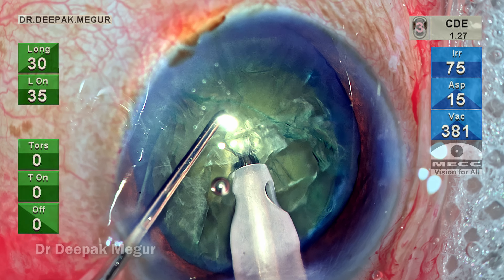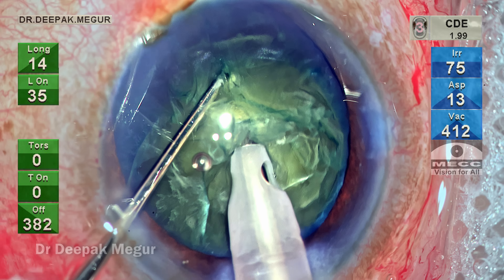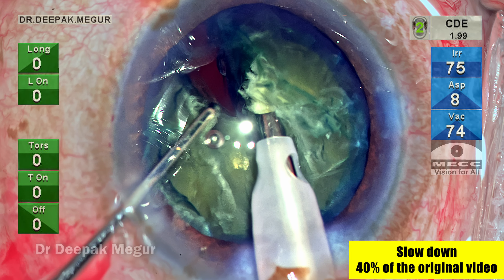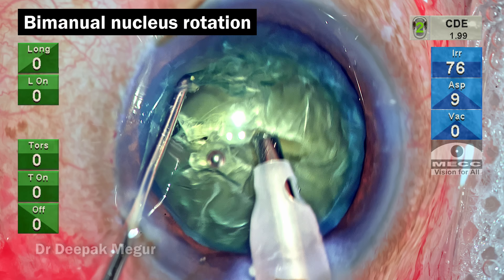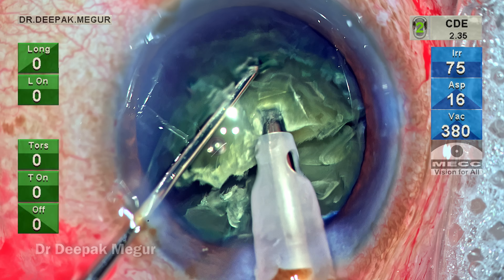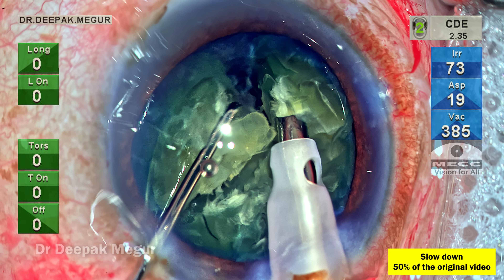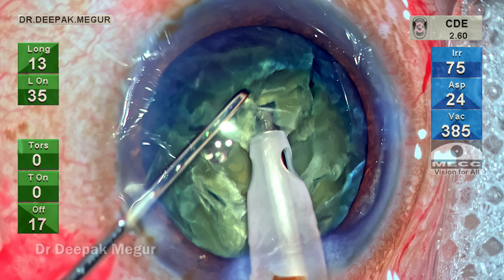The plan is to do a vertical chop maneuver. The phaco tip is buried into the substance of the nucleus, the chopper goes down vertically, and then lateral separation maneuvers are done. I'm very gentle with the lateral separation — not aggressive in getting a full-length crack; the distal half cracked is fine. I gently rotate the nucleus using both the phaco tip and the chopper. Again I bury the tip, the chopper goes down vertically, one attempt then lateral separation. I'm conscious to ensure both fragments are free, while keeping the second instrument within the central three to four millimeters.